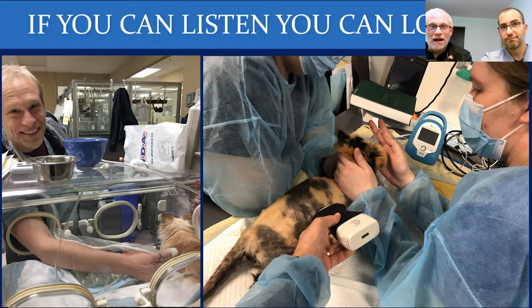I'll say that when I was at Montreal, I used to bring the radiologist into the ECC setting and actually have them help me scan. And they got to a point and said, why aren't you just doing this? So then it actually made that little light go on and say, you're right, I can reach in. I can do point of care ultrasound. I can evaluate this patient myself in the oxygen cage. No stress, no extra work of breathing. Simple thing to get a quick answer. And clearly no stress on your part with that big smile on your face.